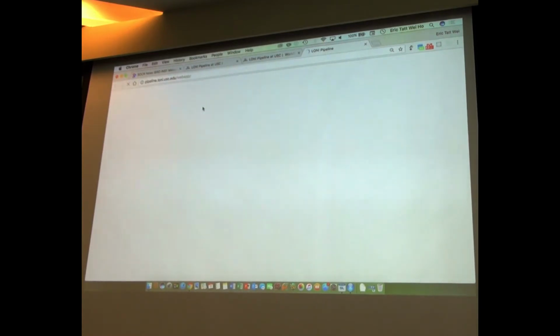So this is to be finalized in the next 6 months or so. But it is working. Maybe about 75 to 80% of the functionality is available in the web app, which does not require Java. The Java web client is the stable version, the currently stable version. Oh my gosh, why is it so slow? Okay, there we go. Something's happening.